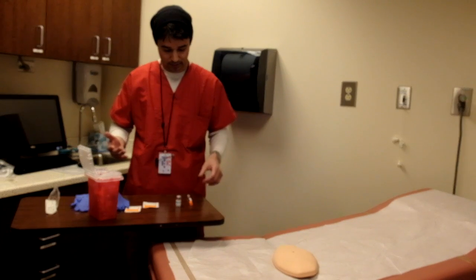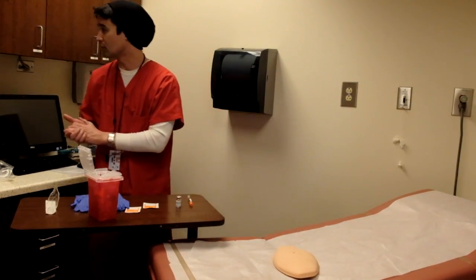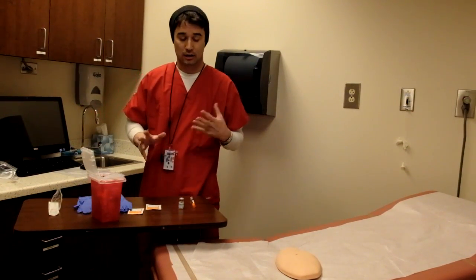Let's go ahead and begin — we have our materials here. I'll begin with my hand hygiene, so normally I would just wash my hands and then get ready here.